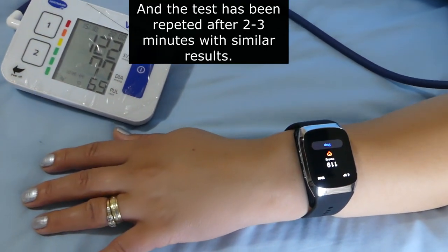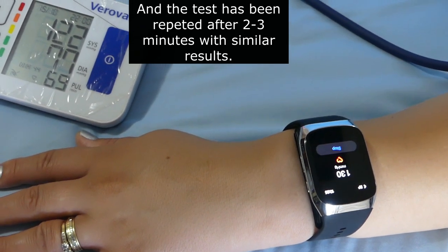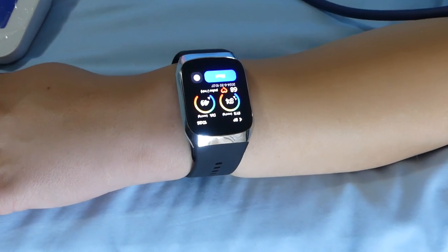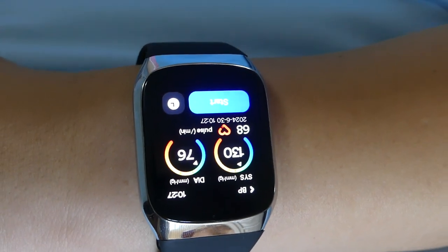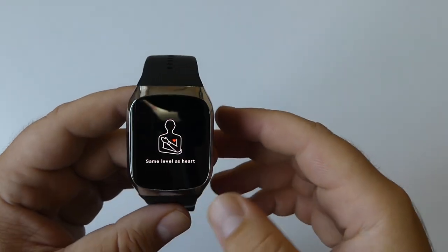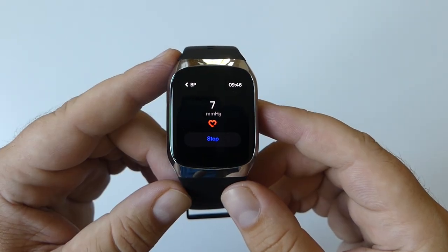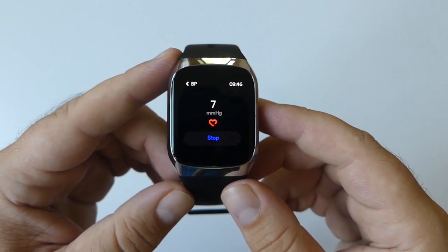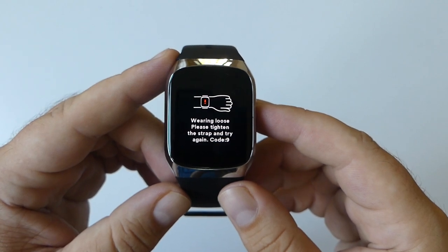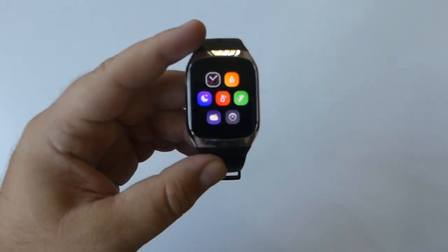Blood pressure values can vary with the measurement period, posture, and degree of relaxation. Common reasons for error codes include wearing the watch too loosely, incorrect wearing position, the air cuff being compressed and unable to inflate properly, or external disturbances such as movement during measurement.